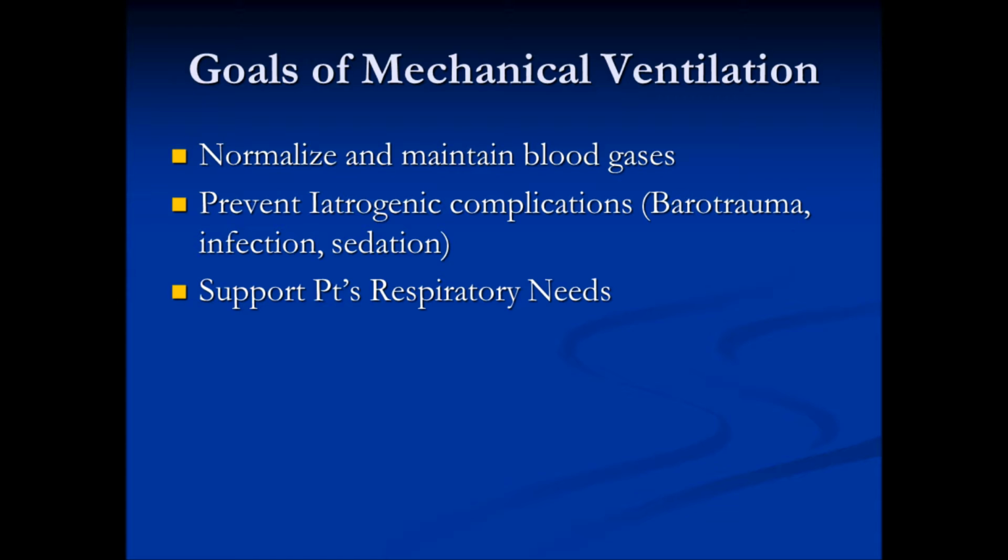But either way, the NBRC can present a scenario in which you would choose any one of these three goals as your reason for putting the patient on a vent.